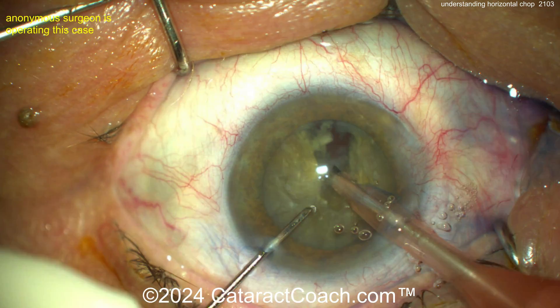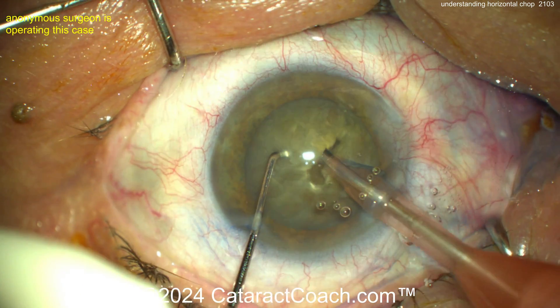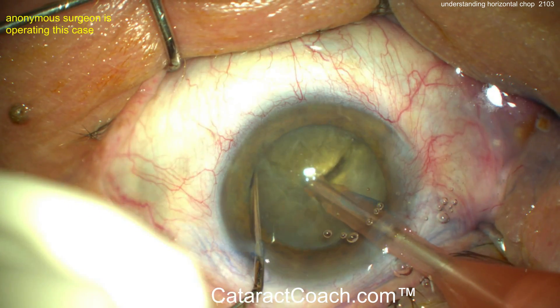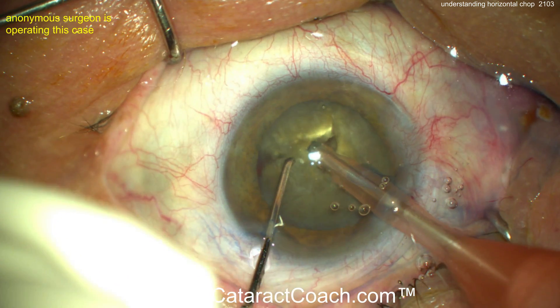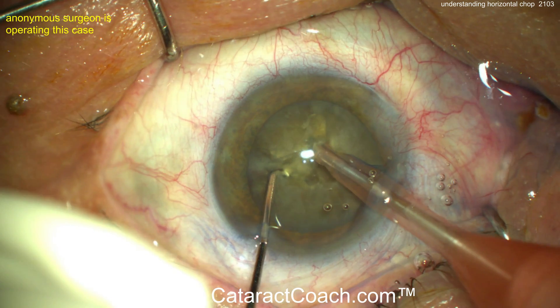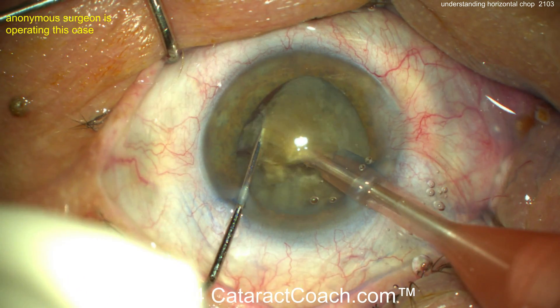Let's watch again. Get the nucleus rotated. The phaco probe is buzzed into the nucleus, chopper goes around the equator of the lens, under the rhexis. Bring the two instruments together and then propagate the chop by splitting them apart. Beautifully done — you can definitely learn this technique.